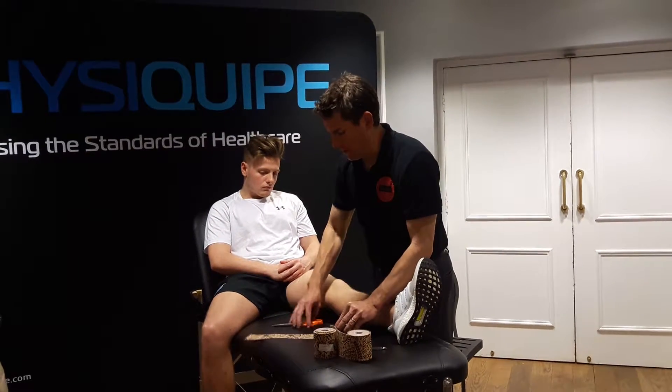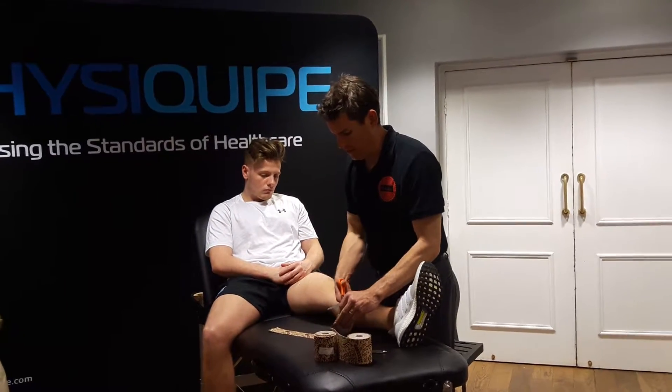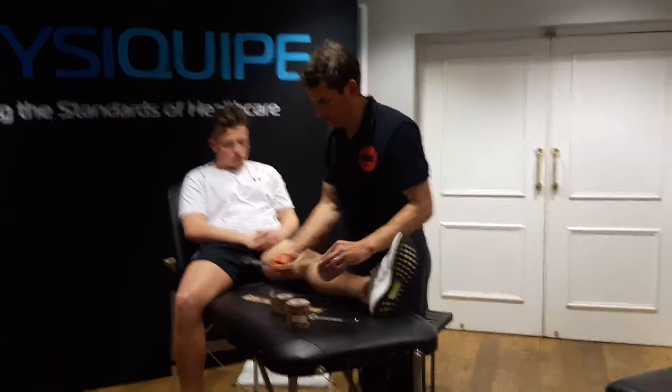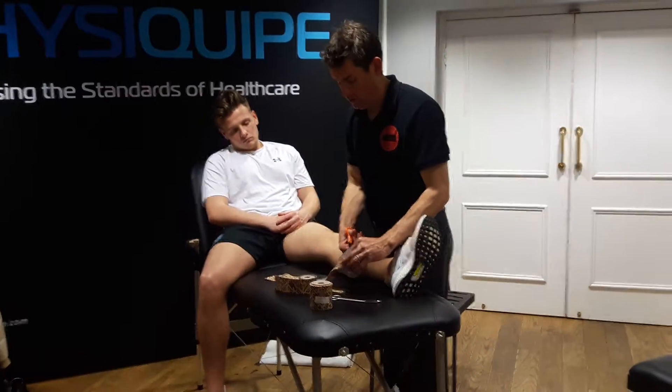With any of these things you can create power bands. We're going to do that here in a second for one of the tapings. But for now I'm going to show you the sort of layered effect of what you can do with dynamic tape.